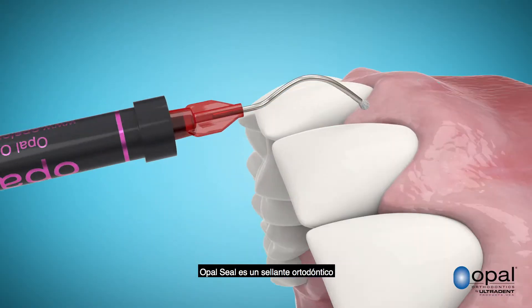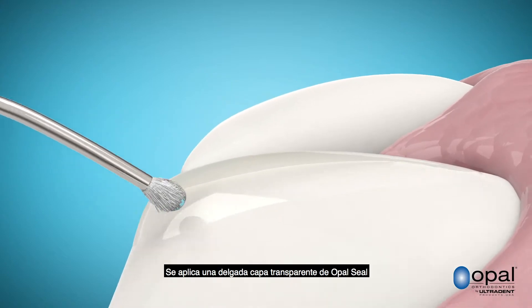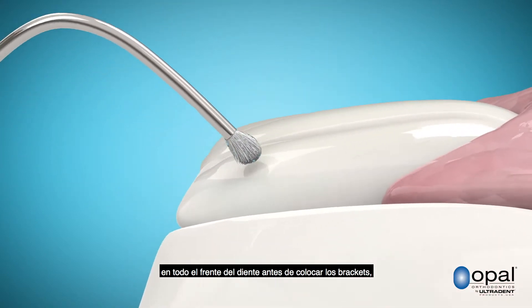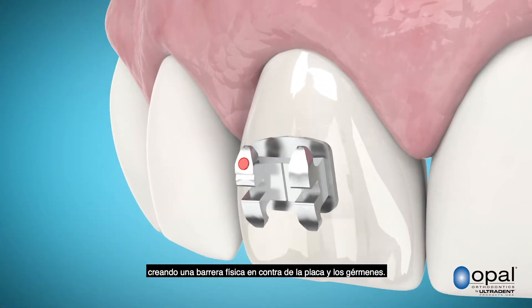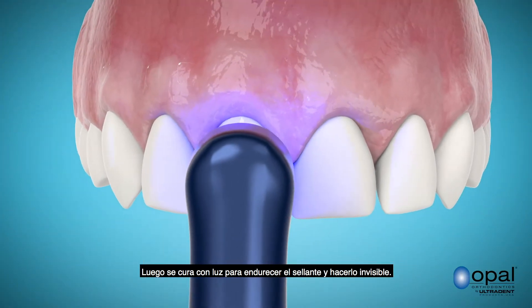Opal Seal is an orthodontic sealant that is designed to safeguard your smile. A thin, clear layer of Opal Seal is applied to the entire front of the tooth prior to placing the braces, creating a physical barrier against plaque and germs. It is then light-cured to harden and become invisible.